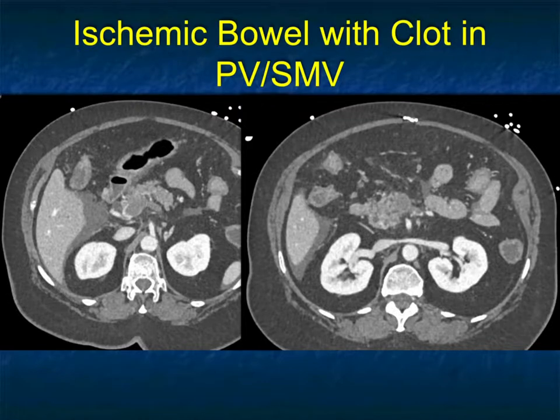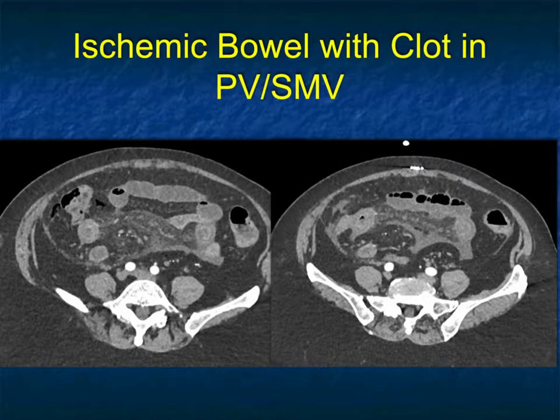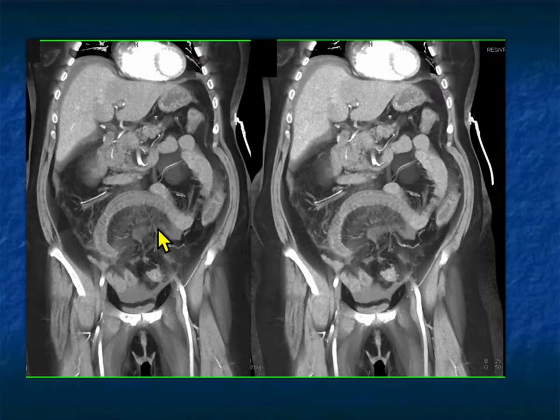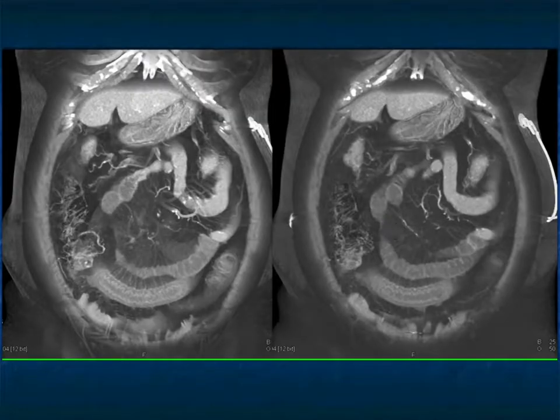Here's a good example of SMV and portal vein thrombus. You also see ascites and stranding. Scanning downward, the bowel loops are dilated and there's inflammation in the mesentery. We spoke about fibrofatty proliferation of the mesentery in Crohn's, but this haziness can be due to inflammation from ischemia. On the coronal view, you see long-segment bowel involvement, small vasa recta, and haziness/inflammation in the mesenteric fat.